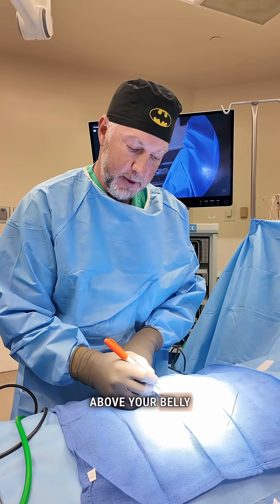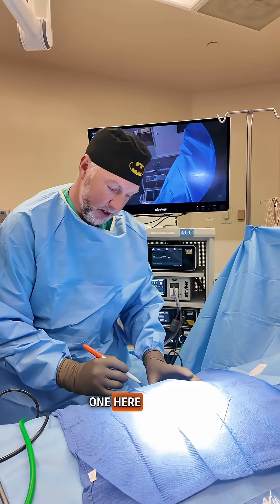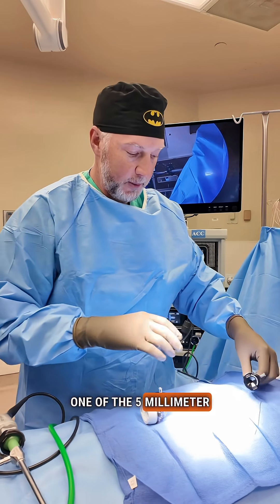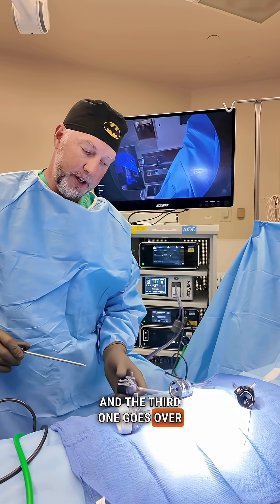Now we're ready to go. I make an incision just above your belly button here, a second small incision up top here, and two other incisions — one here and one down here. The 12 millimeter port goes right here, one of the five millimeter ports goes here, the second one goes here, and the third one goes over here on the side.